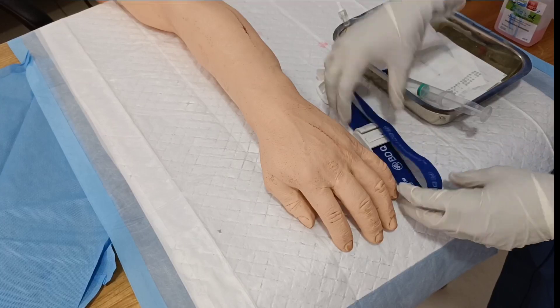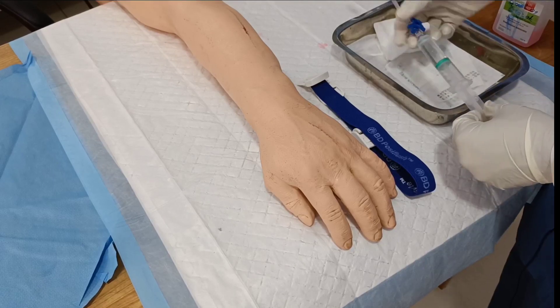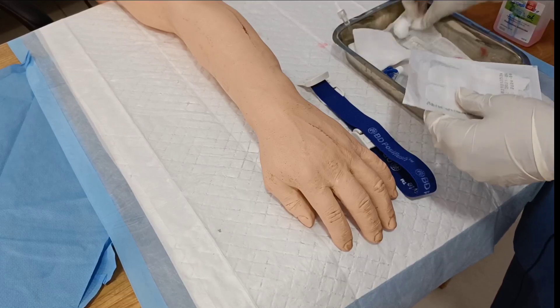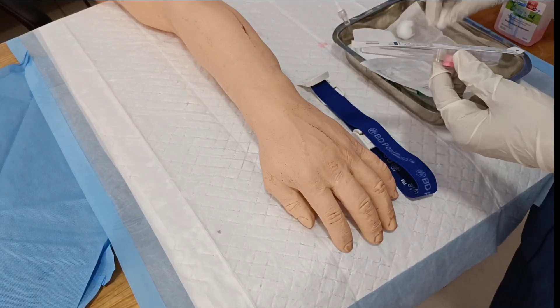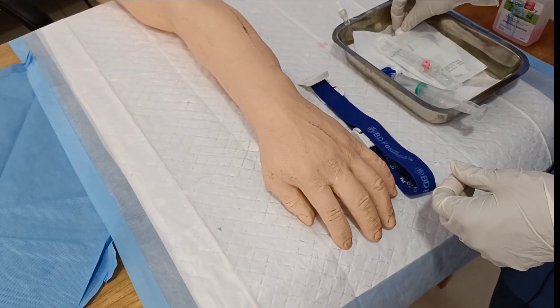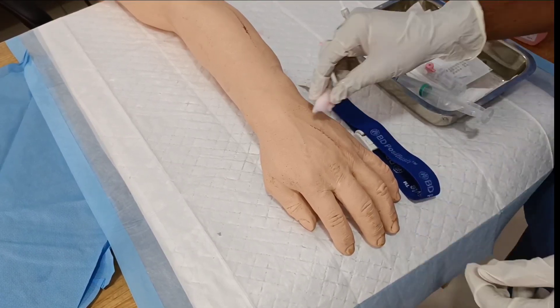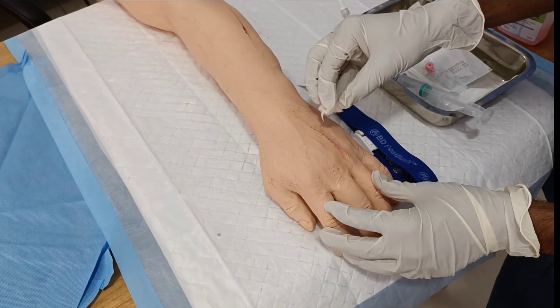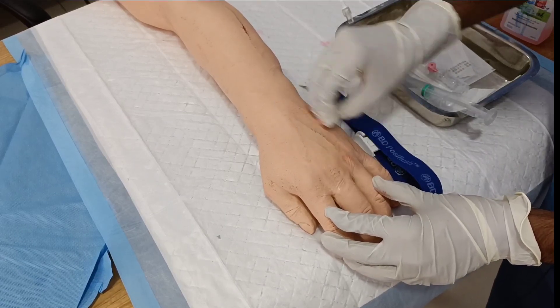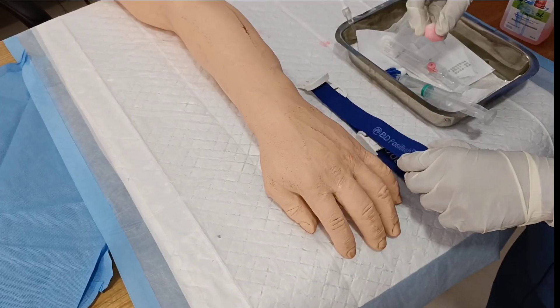We have to clean the cannulation site with an alcohol swab in a circular motion from center to periphery, to avoid bacterial infections. Let it dry for 30 to 40 seconds. Meanwhile, connect the tourniquet approximately at some distance from the site of cannulation. Then gently palpate the area to dilate the vein and select a good vein — it has to be straight, bouncy, and easily palpable.